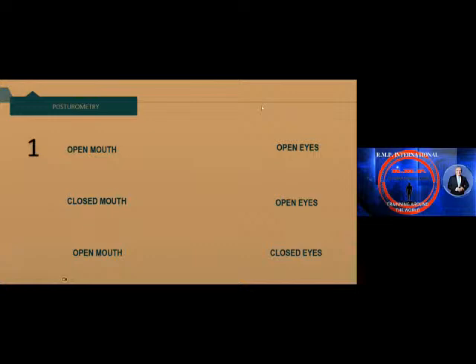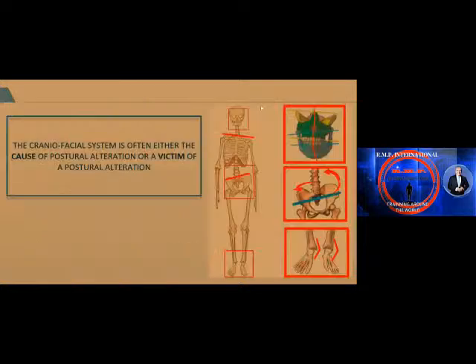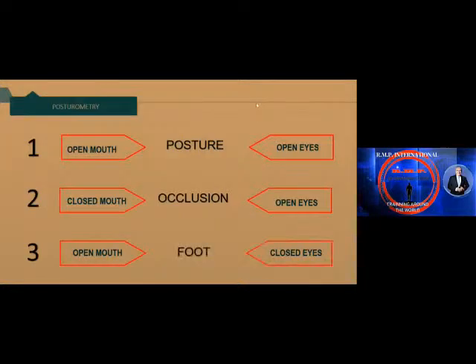With these three tests, we measure the posture of the body, the effect of the craniofacial system on the body, and the foot support. Very simple test, very easy. It takes 30 seconds to do that.